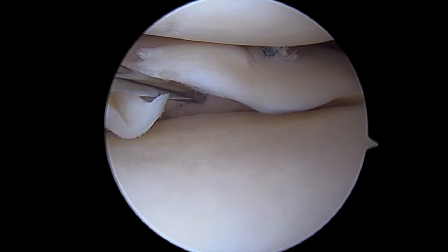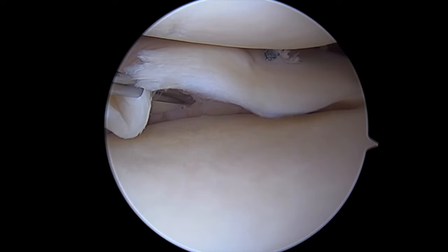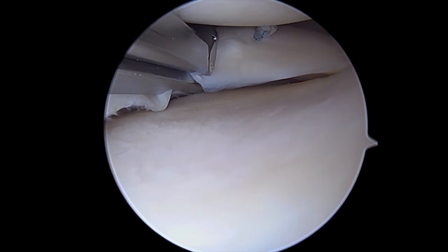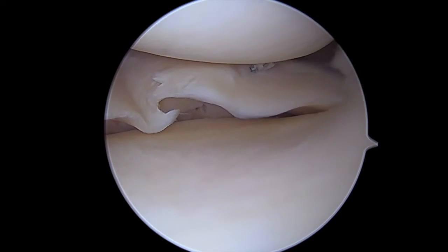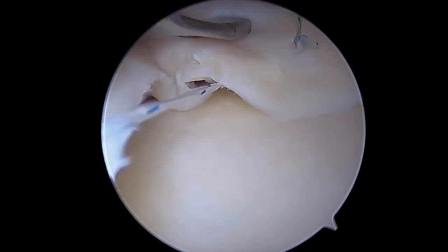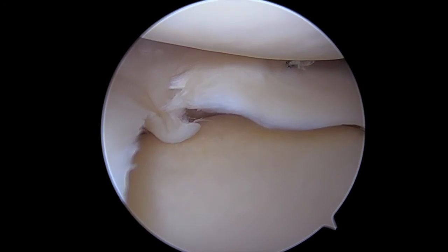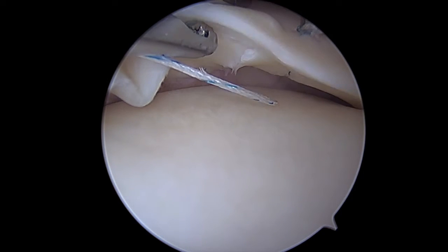If you're meeting a lot of resistance, you want to pull back out, go back in, re-trephinate, make sure that you can get that lower jaw through, and then go ahead and pass up and around, and then pass your central stitch. You'll see this lower jaw — watch it — see the cartridge is pushing out from underneath the device? That tells me there's too much resistance. This is learned from experience. Once I re-trephinate, then I can get a good pass in there with another cartridge and get all the way around it.